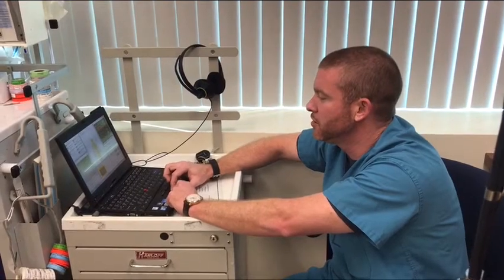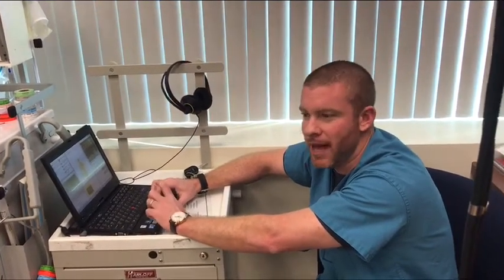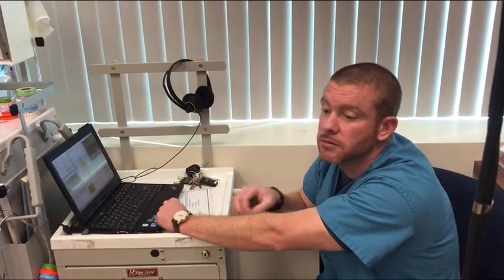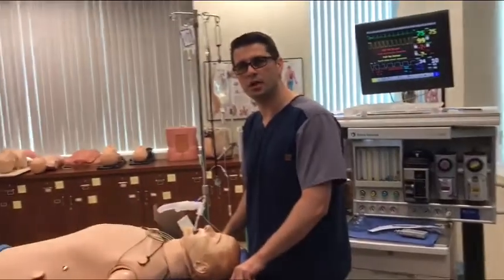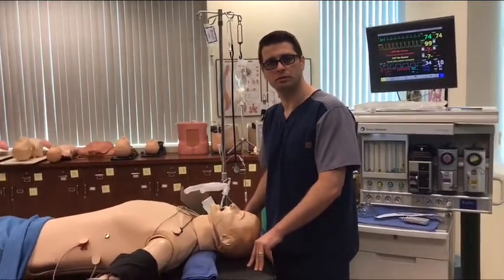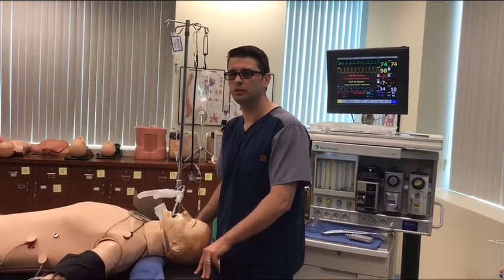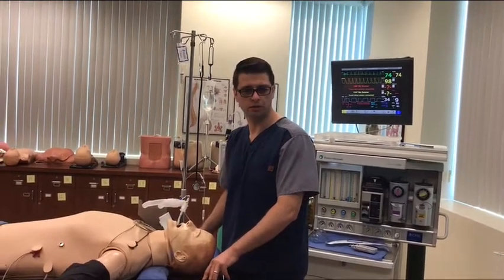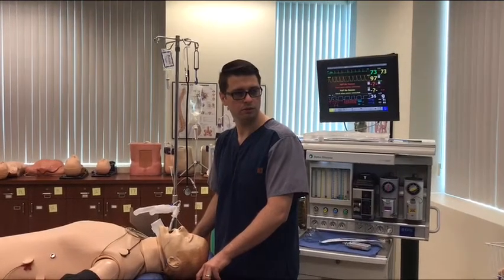You got some twitches. Four of them. Okay, he's all the way back, so I'm going to give him another. The procedure is like two hours? How long does it take? 30 minutes to 2 hours, I think. So I'm going to give about 50 of rocuronium. I like 50 of rock.